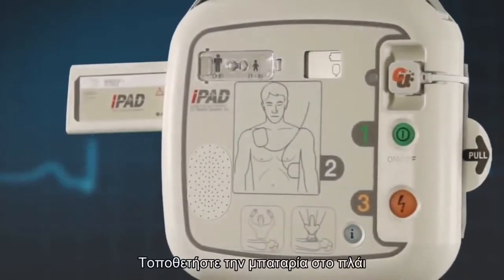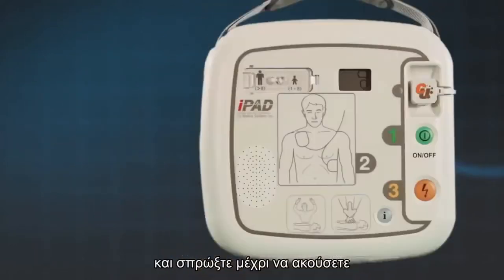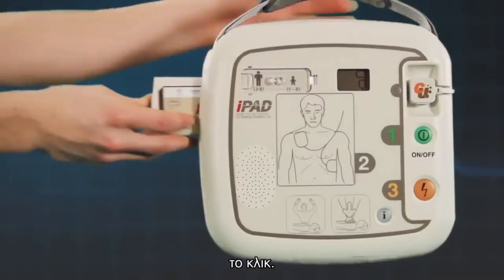Next, insert the battery pack into the side of the AED in the direction of the arrow on the label. Push it firmly until you hear it click into place.